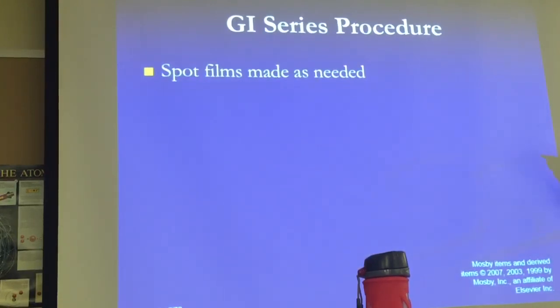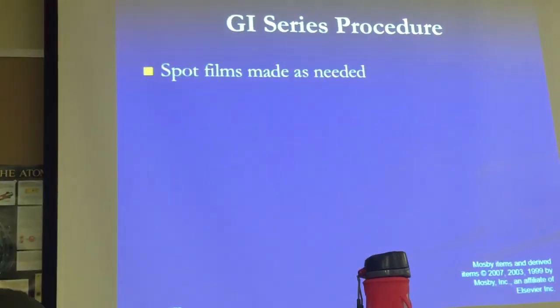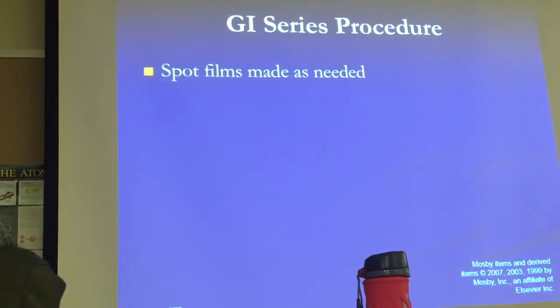Just remember that when we talk about spot films, the doctor switches the mode to radiographic mode, and it takes seconds. It takes a picture and goes back to fluoro. It's even using the image intensifier. He's using the tower. Are you following me when I say tower, image intensifier? To capture that permanent, regular picture. And that's why many radiologists don't want you to do overheads anymore, because the quality of the images nowadays is really good. There's no need for you to do extra pictures. Are we all right? Okay, good.